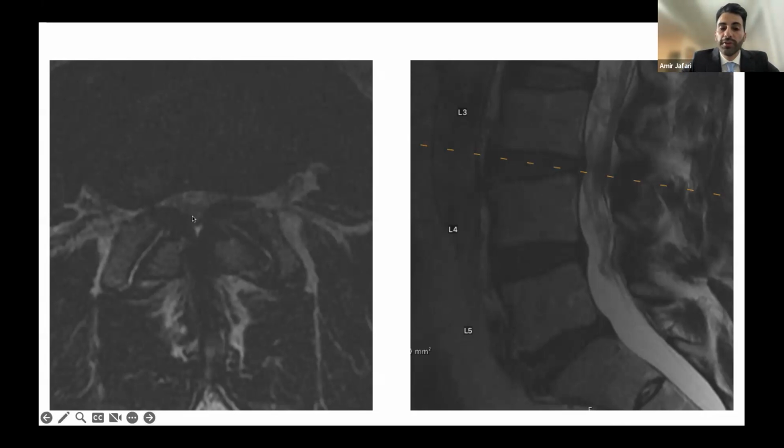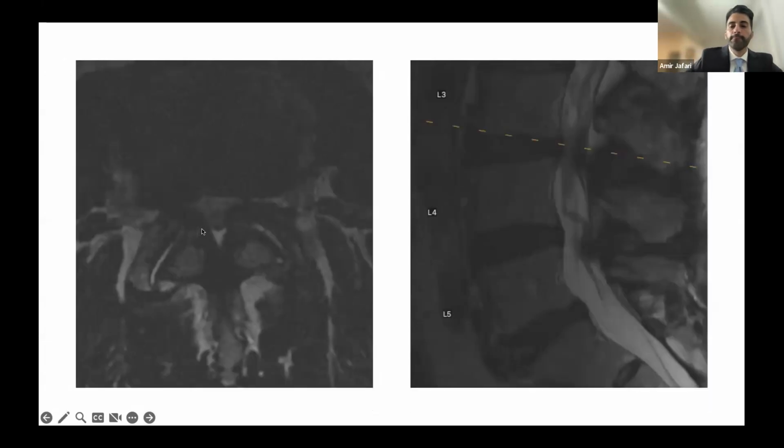If there's no epidural fat, I get worried because I usually break the ligamentum flavum in this area, and then I start chomping it away towards dura. When there's fat, there's a gap between the ligament and dura. So when you poke a hole in the ligament, you know that there's some safety mechanism back there: you will have an empty space behind it, so you won't poke the dura.